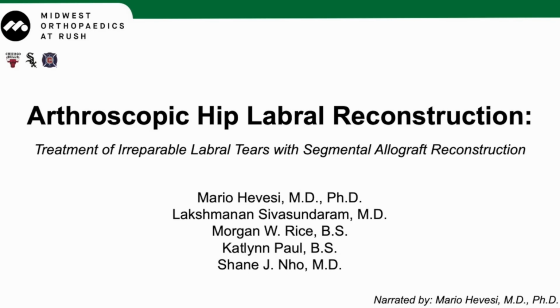The following video will focus on arthroscopic hip labral reconstruction, namely the treatment of irreparable labral tears with segmental allograft reconstruction.